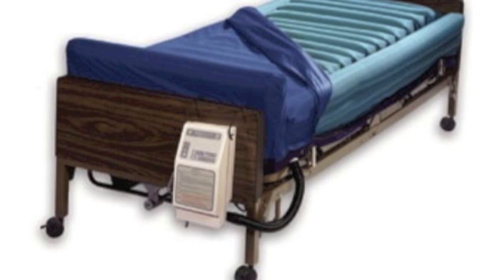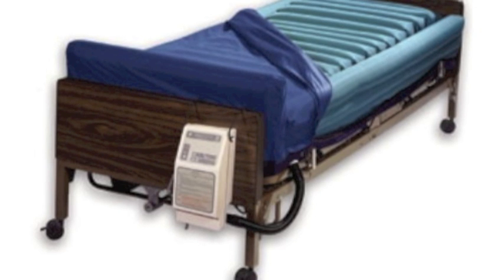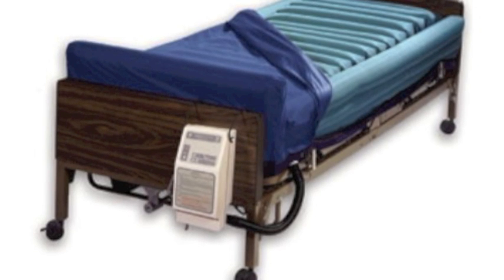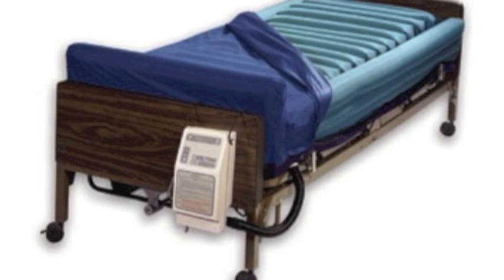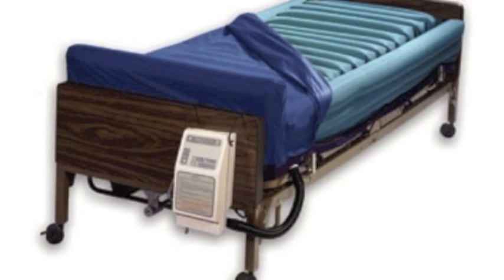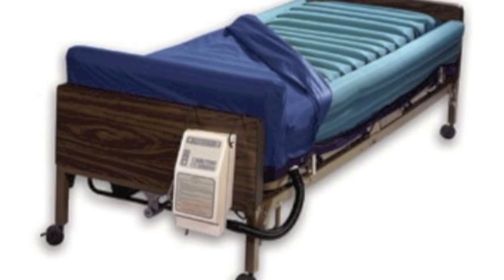In the picture provided, the protective cover is the shell that is partially over the mattress. In this first step, only the cover will lie on the frame. Referring to the picture again, we are able to see the placement of the air hole in which the hose is attached to. Open up the protective cover at one side with the allocated zipper. Place the mattress pad inside of the cover. It should lie flat and fit easily in the bottom.